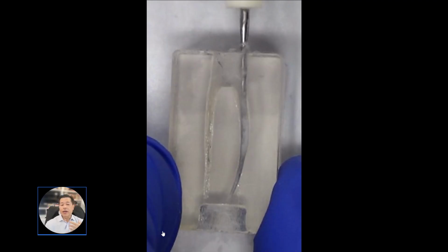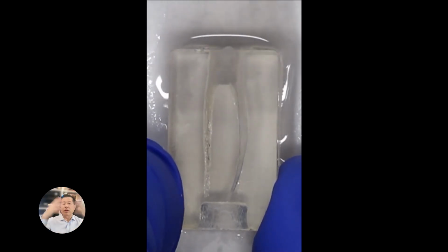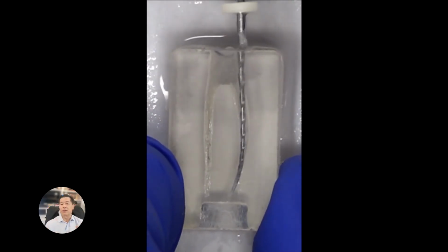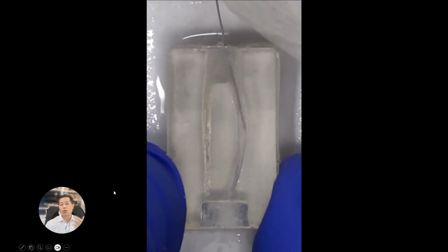But in a tooth, that would be the walls, the dentin. It could be tissue, it could be blood, it could be the purulence that's in that tooth. Just all not good stuff. Now when we irrigate, the irrigant is rinsing all that out. It's disinfecting, dissolving the tissue, but it's removing all that dental mud. When we go back in with the files again, all we're going to do is make it cloudy again. So see, it just gets cloudy because we're scraping the walls and we're creating more mud.